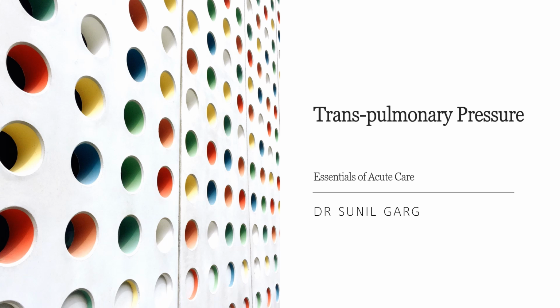In our last video, I discussed driving pressure. Though driving pressure is a reliable pressure variable and based on sound physiological principle to determine appropriate tidal volume in heterogeneously involved lung in ARDS patients, it becomes less relevant in patients with poor chest wall compliance, like patients who are obese, patients with abdominal hypertension, and pregnant patients. In such patients, transpulmonary pressure seems to be a more appropriate parameter.